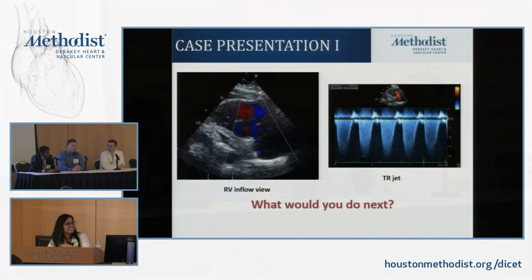In this particular patient, one of the problems that we had with her was that she had HIT and she thrombosed her conduit, which is an interesting problem. Translate that into a bad problem. You're letting the cat out.